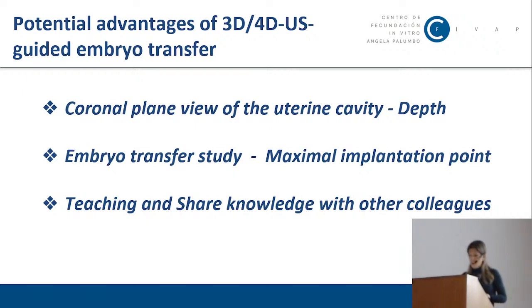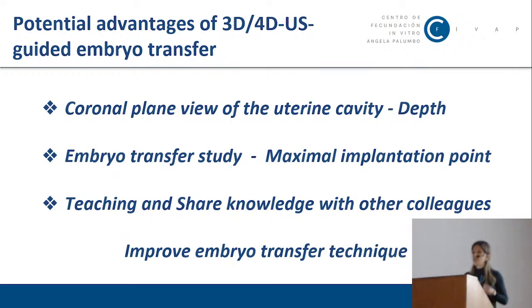We can perform studies to better define what and where this ideal maximal implantation point is, and the ability to store volumes and reevaluate them at a later time for teaching and knowledge purposes. And finally, all this may be useful to improve our embryo transfer technique.